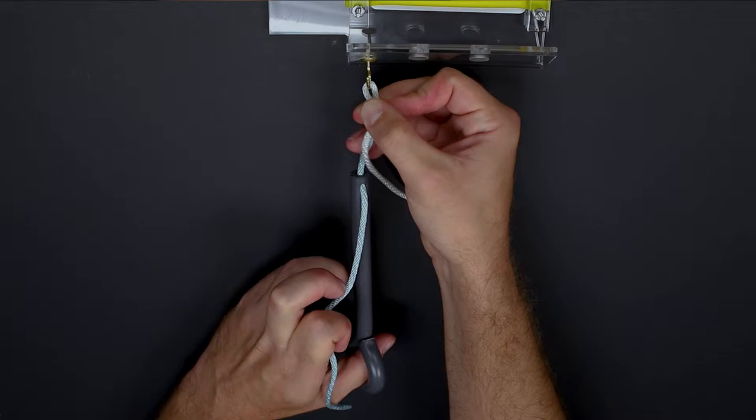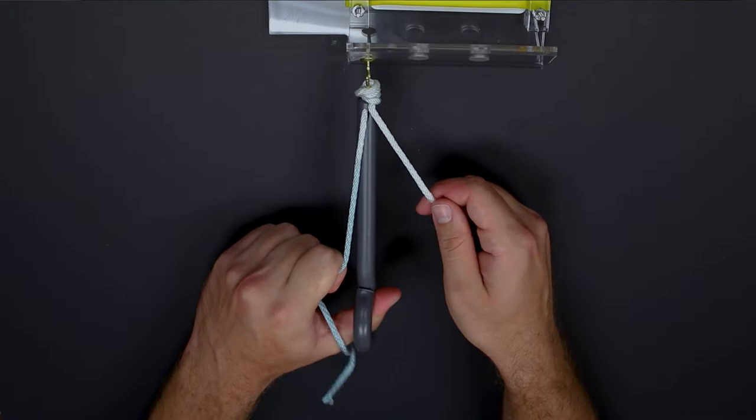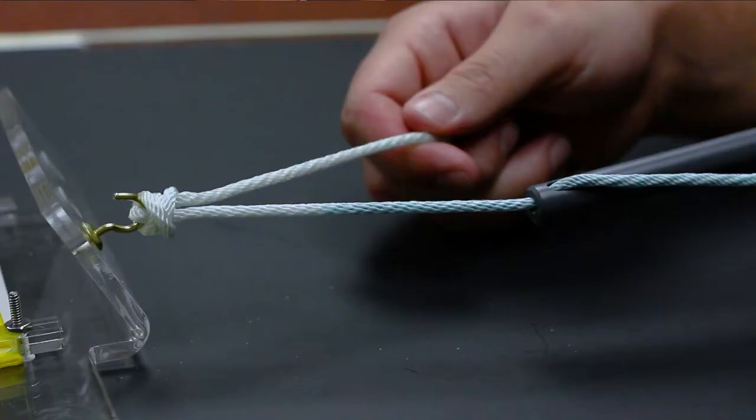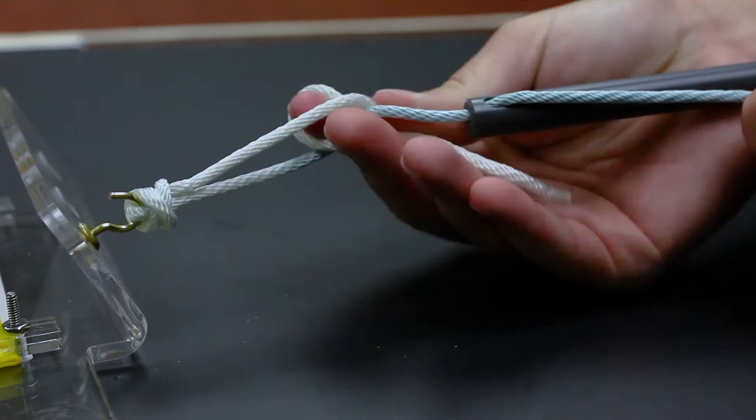The important thing to note in this type of knot is there is no locking mechanism so this can loosen against the tissue, so it is important that until this is secured down with three half hitches on alternating posts that one holds tension on the post limb.